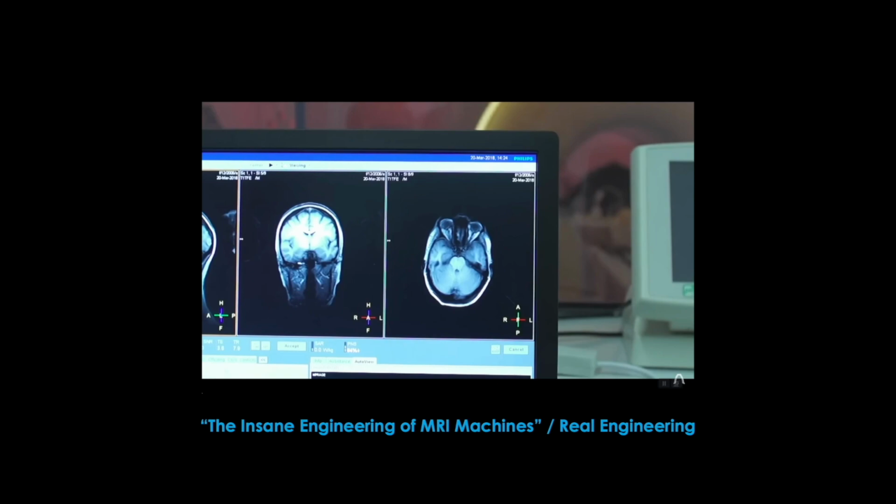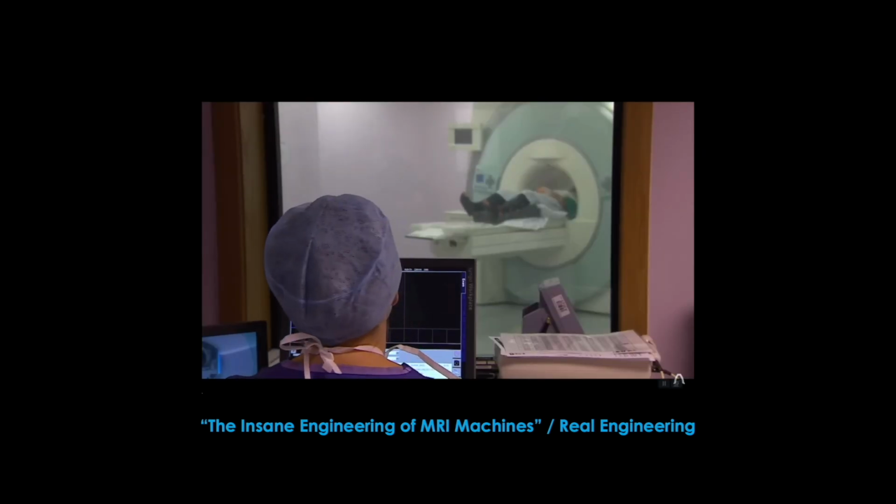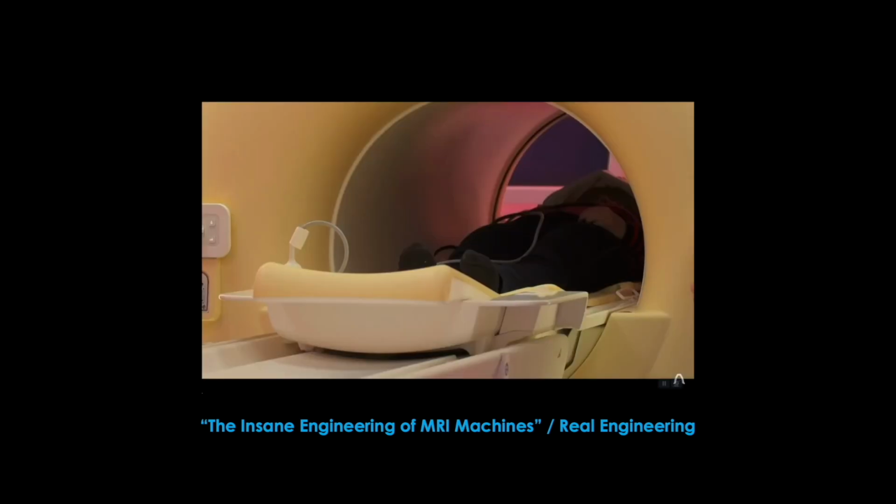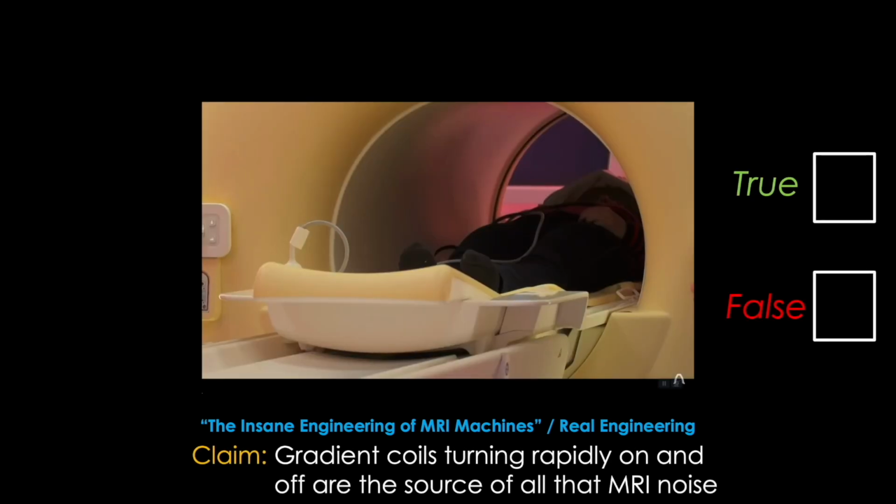Okay, next clip. Gradient coils rapidly turning on and off are the source of the loud clunking sounds in MRIs. Claim. Gradient coils rapidly turning on and off are the source of the loud clunking sounds during an MRI scan.